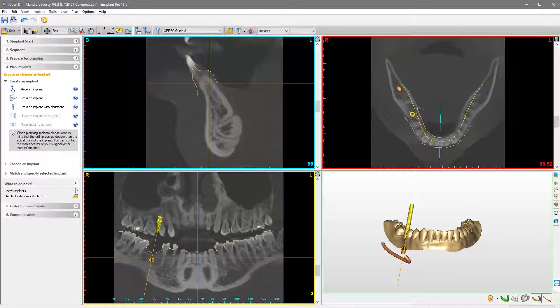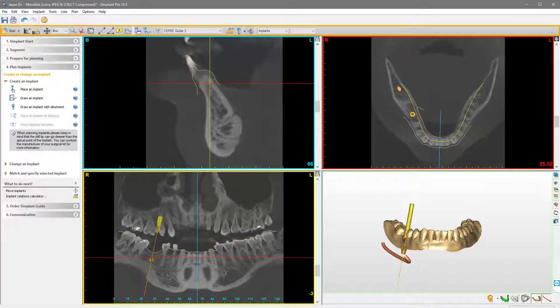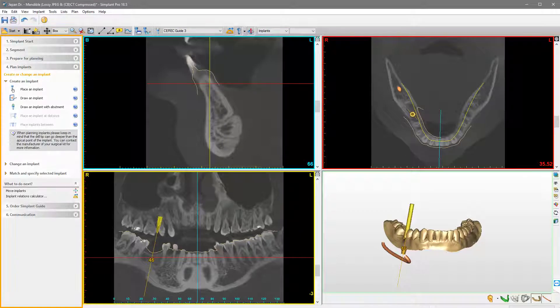The interface is divided into different sections. On the top, you find the toolbar for quicker access to some frequently used tools. On the left side of the screen, the task panel is displayed, which guides you step-by-step through the implant planning workflow.